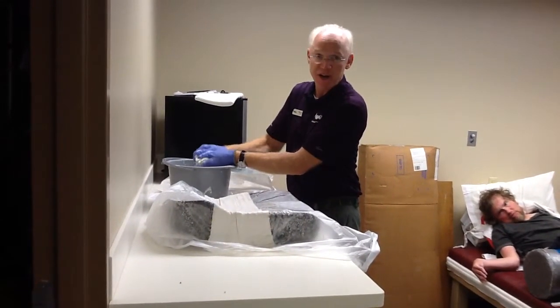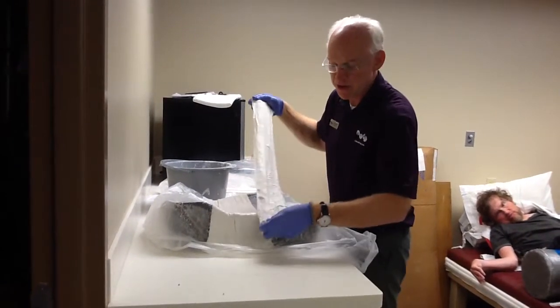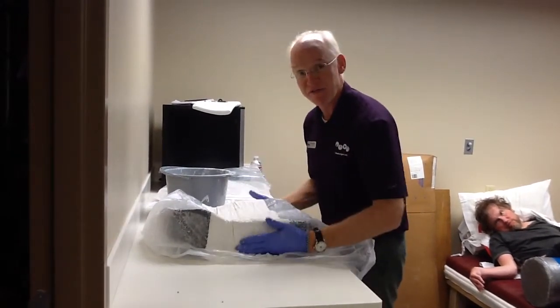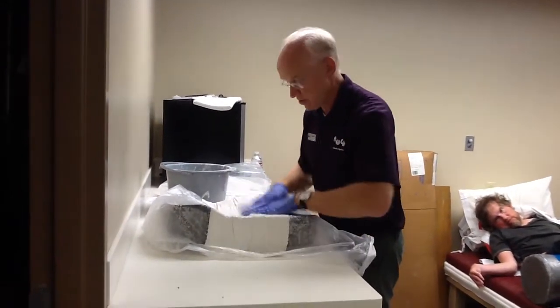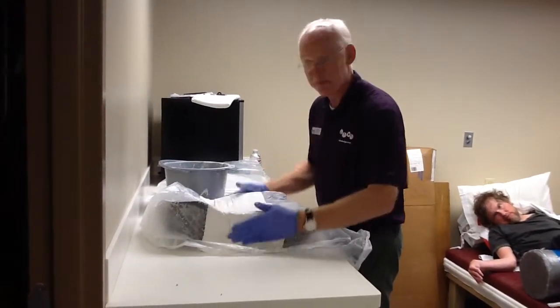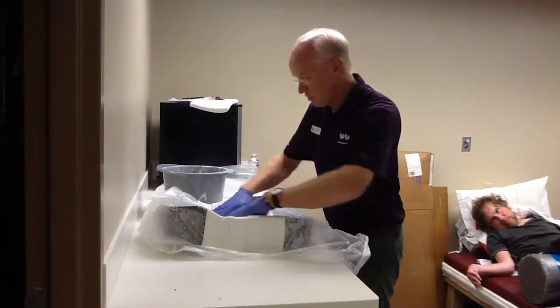Loading contour is responsible for safe, good skin outcome on the areas that we're loading. It's also responsible for posture. So if you've got good offloading, good skin response, good orientation to the chair, and a good postural outcome, the last thing you want to do is capture a new shape. You want to use what they've got.